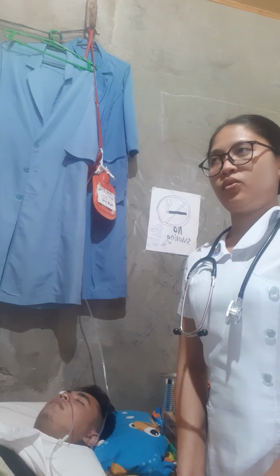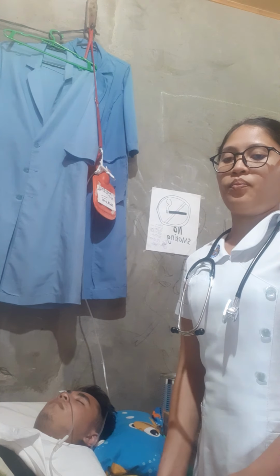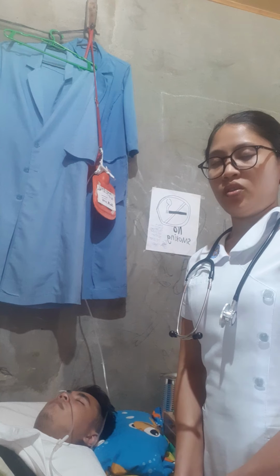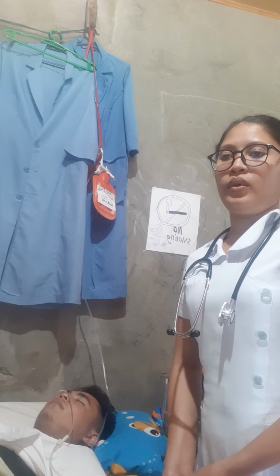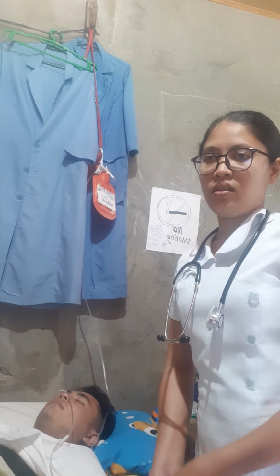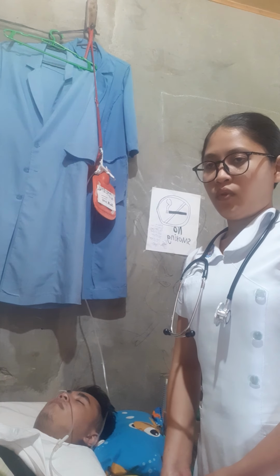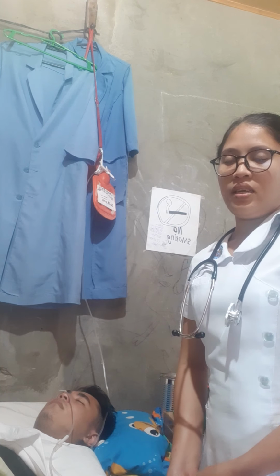Afterwards, dispose of all materials and equipment in the appropriate place. And if the equipment is reusable, clean it, wash it with soap and water so that it will be ready to use again. If we need to use it, then change the equipment every 24 hours according to the hospital's policy, and wash hands.